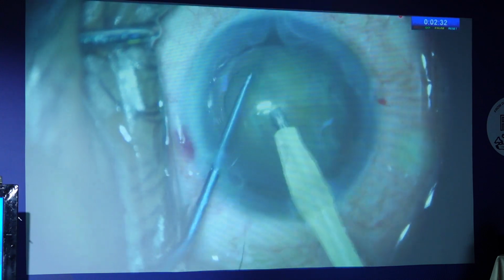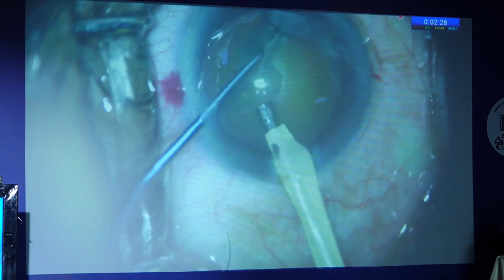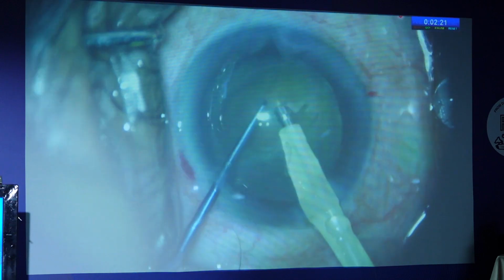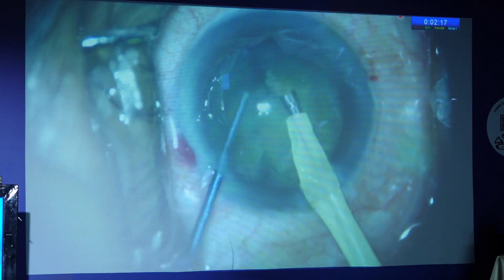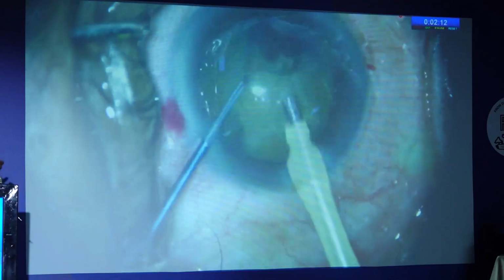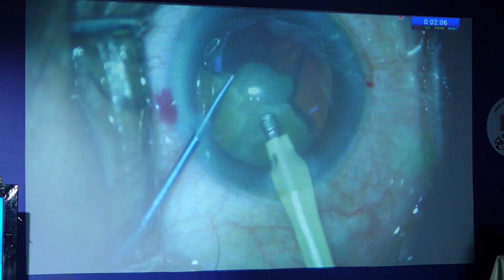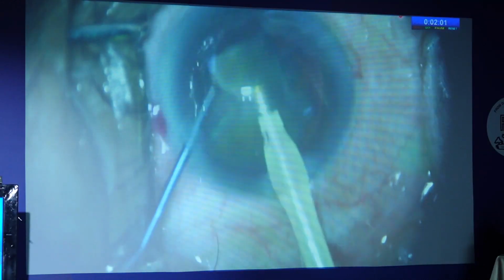Before I conclude, I'll just show a video where a fairly hard cataract is being emulsified, and mind you, the flow rate is almost 90, and the vacuum is almost about 800. You can notice I did not have to make very small fragments because the followability is good, and you can actually catch hold of the nucleus pieces without having to worry about those pieces being thrown off from the tip.